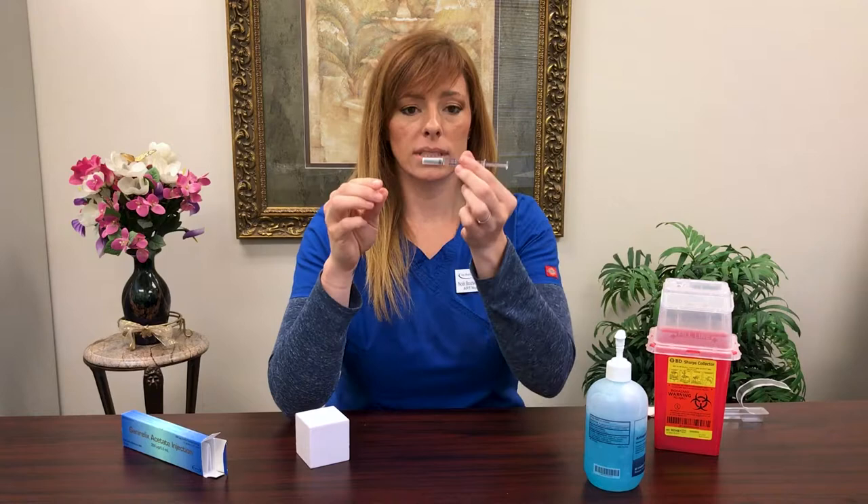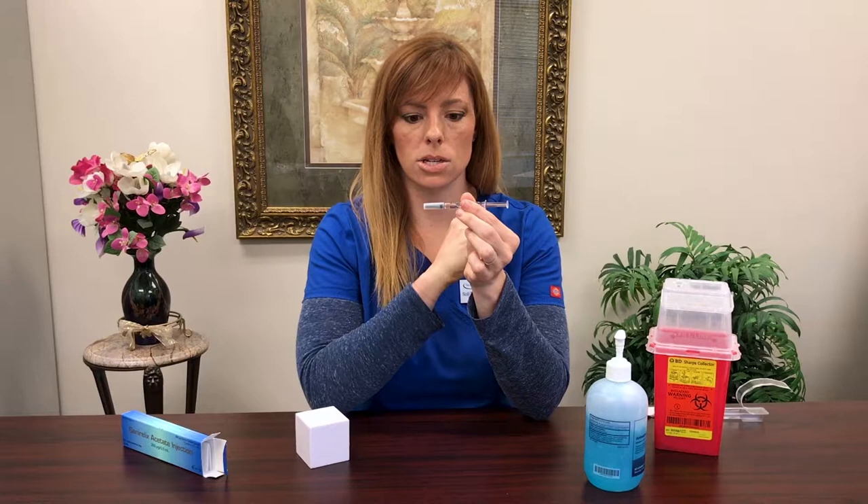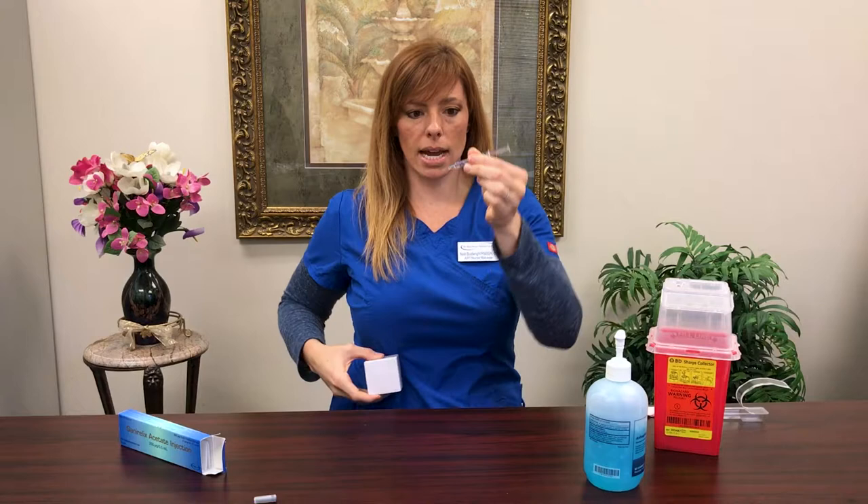Holding it level, your air bubble should be at the very end close to your stopper where the end of the syringe is. Once you pull the gray stopper off, when you go to inject, the air bubble is going to be closer to your fingers. That's okay — that's where we want it.